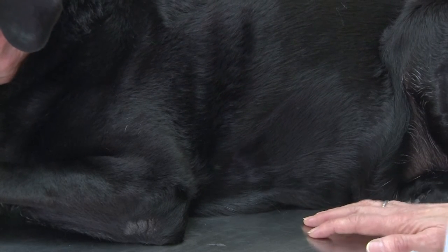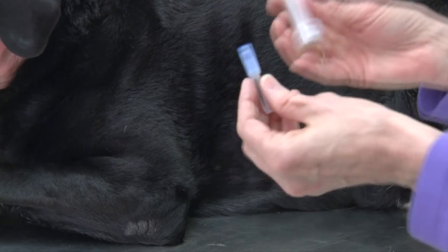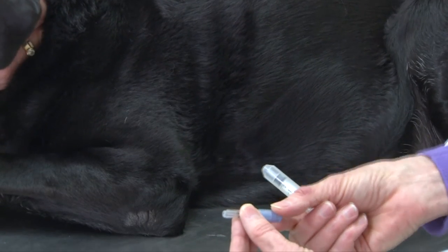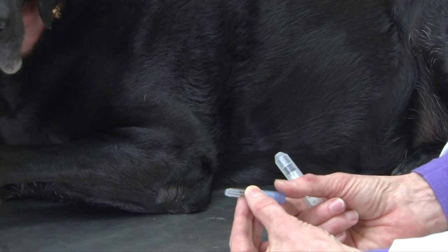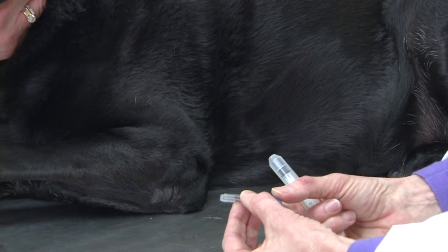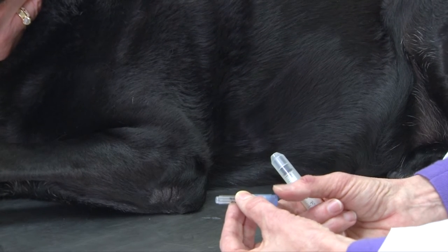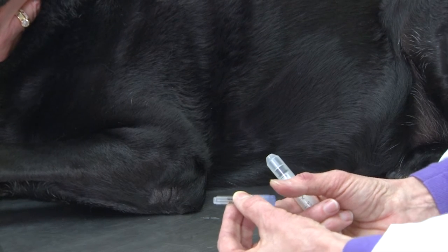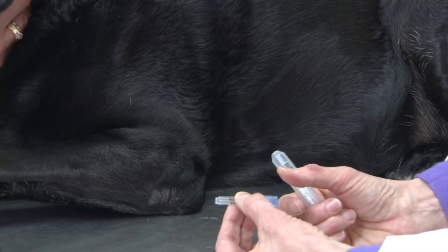The first step in this procedure is to have a syringe and needle. I have a 22 gauge needle — one can use 22 or down to a 25 gauge needle. We should not use a needle larger than 22 gauge because that will result in blood contamination of our sample, and that applies even to large animal species where one might think a larger needle is needed, but it is definitely not necessary.